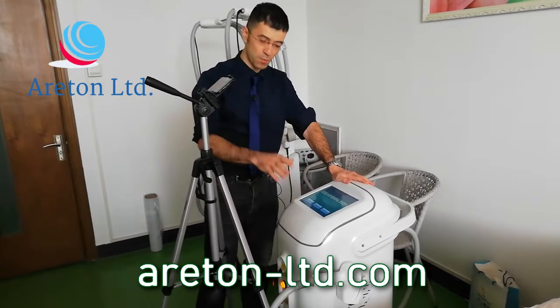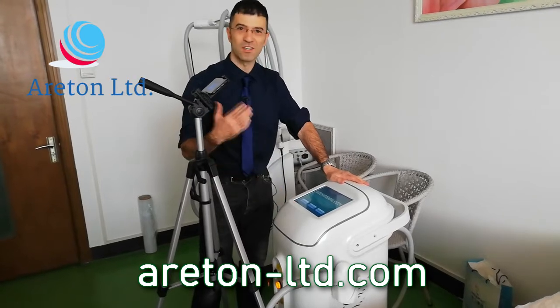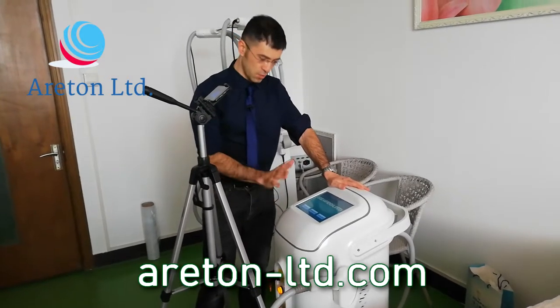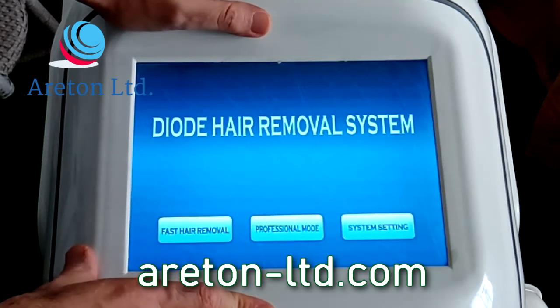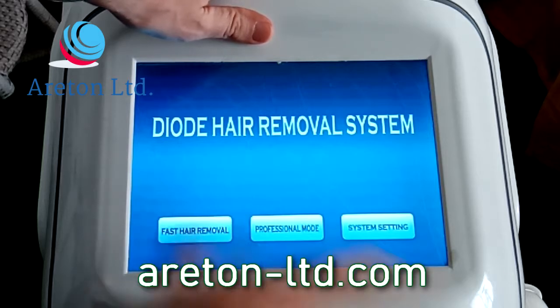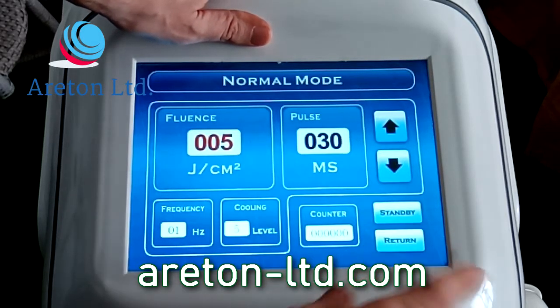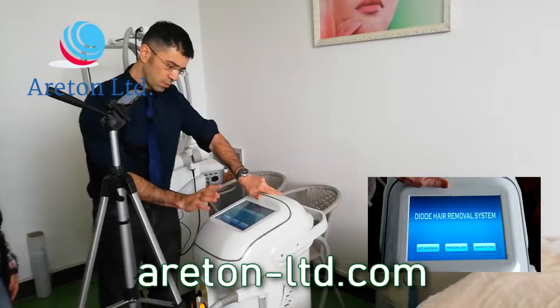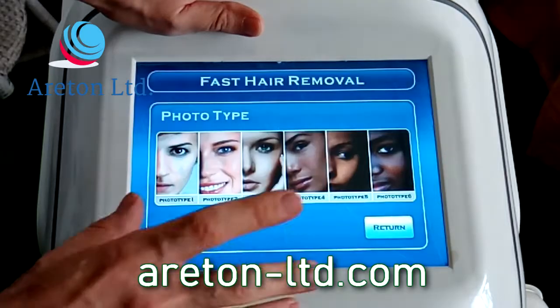So in this video, we're going to show you, first of all, how the equipment works, and it's extremely easy to use. So this is the way it presents itself. What you do is you press on, you've got the professional mode, which we're going to go into later on. So we're not going to talk about the professional mode right now. We're going to talk about the easy way to use it.